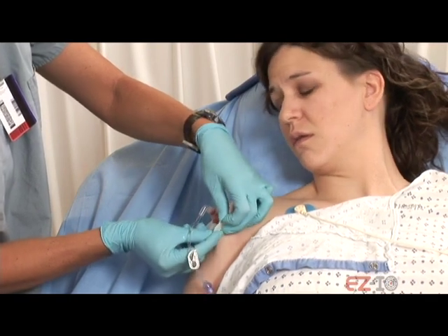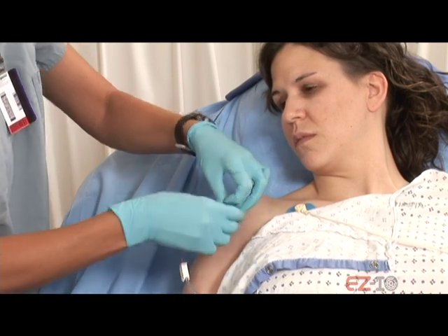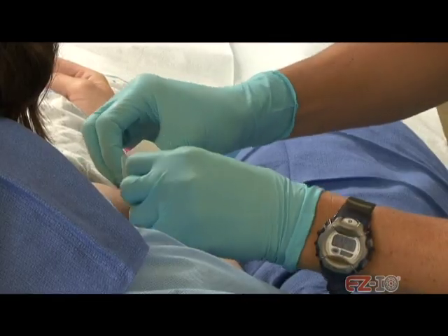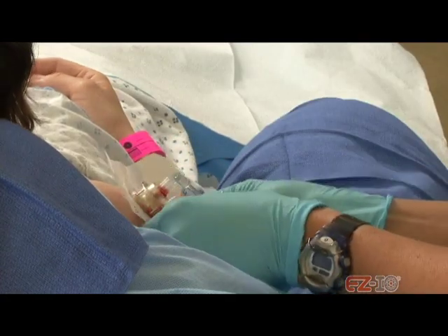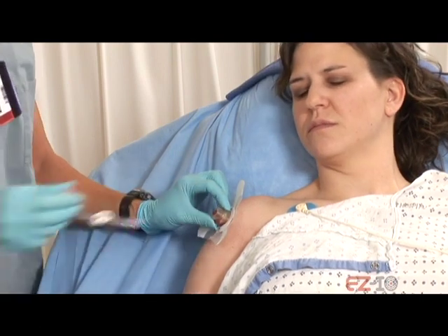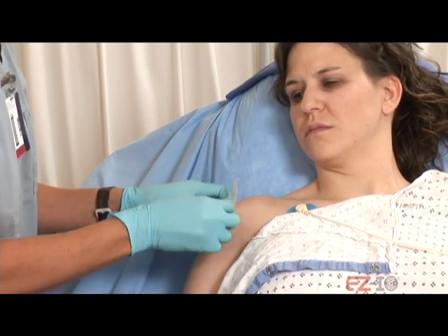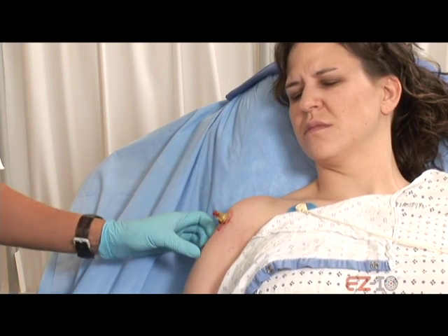Doing okay? Mm-hmm. All right. Okay, so now I'm just going to take this off, and I'm just going to pull this right back up and over. So this is just the stabilizer, it's not taking the needle out.